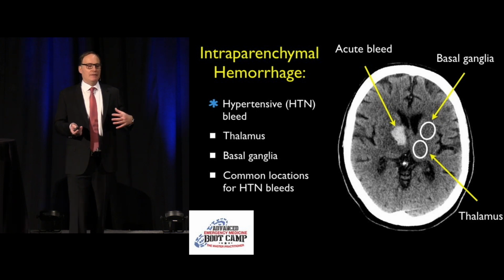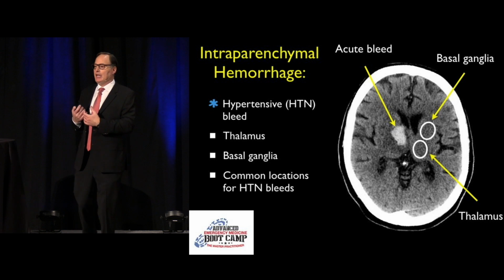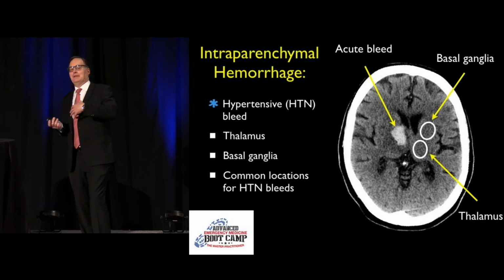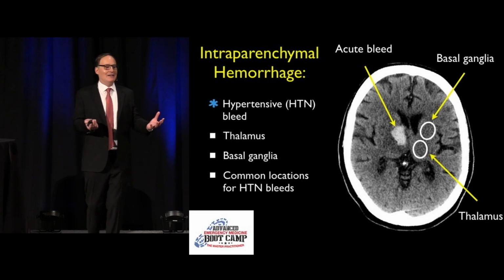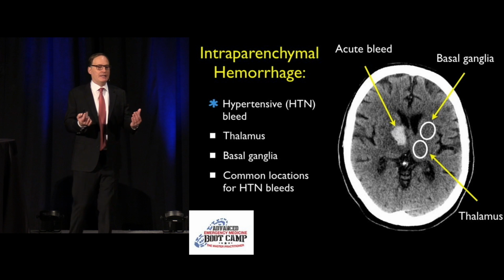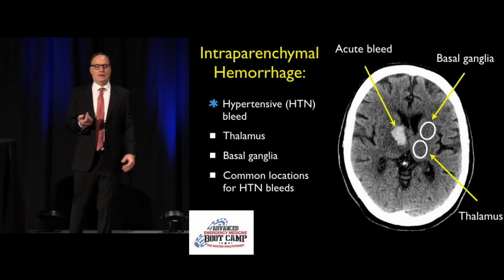I think the question that comes up to me a lot from my residents is, do I need to scan every patient who comes into the emergency department with a headache? And I think we would be doing a lot of CAT scanning if that's what we were doing. However, this patient had frank neurological deficits, and when I tried to get the patient up to walk, the patient was very unsteady, okay? So that's a tip-off that there could be something going on here.